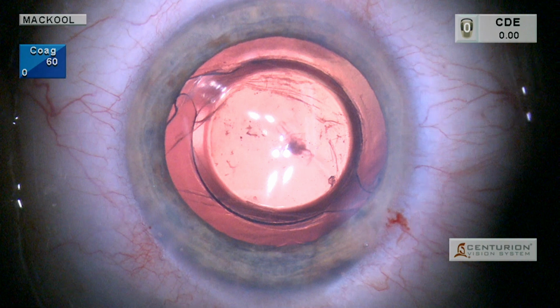And following the OVD irrigation from the anterior chamber, we would typically inject a miotic agent such as Miostat in order to reduce the chances of an intraocular pressure spike in an eye in which we probably are not going to remove all of the OVD.